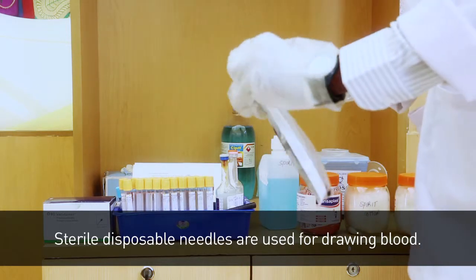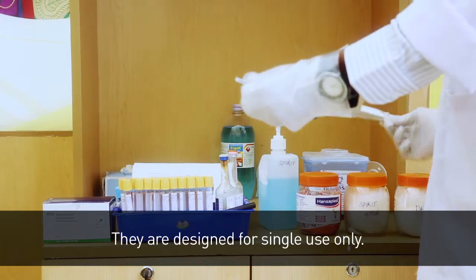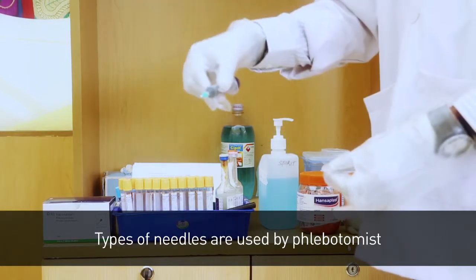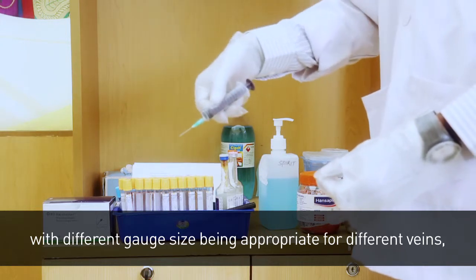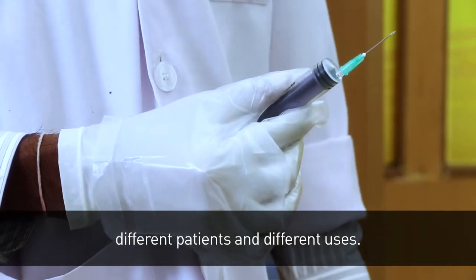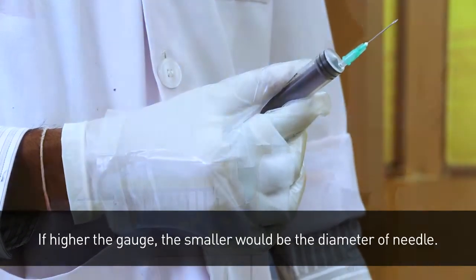Sterile disposable needles are used for drawing blood and are designed for single use only. Different types of needles are used by phlebotomists, with different gauge sizes being appropriate for different veins, different patients, and different uses. The higher the gauge, the smaller the diameter of the needle.